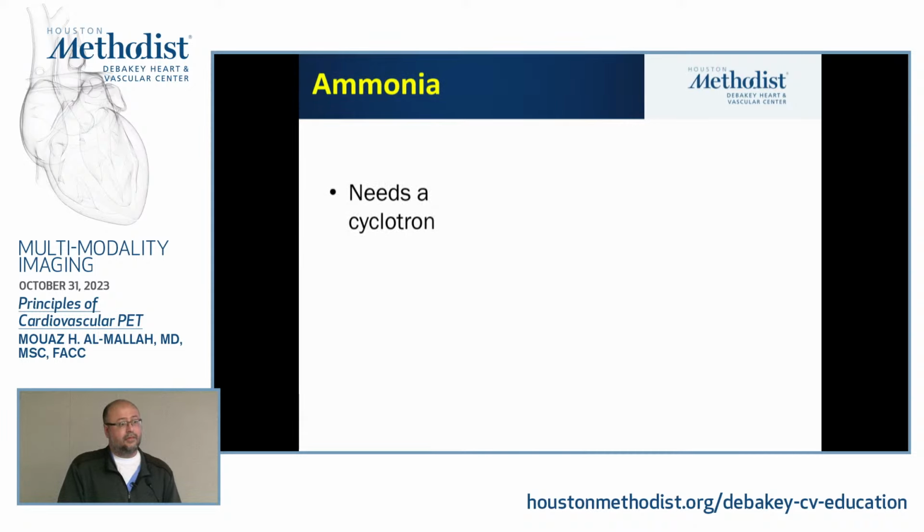Sir, one question. How do they use O15 water in Europe if the range resolution is bad and you have low count rate in imaging? So it's primarily dependent on flow. Mostly on the flow. So they make their decisions primarily on the flow. You don't get ejection fraction, because it goes in and out. Now there is one company that has software that, based on the first pass, can potentially give you an image. But again, this is still work in progress. But O15 water, like all these specific trials, was purely flow data.